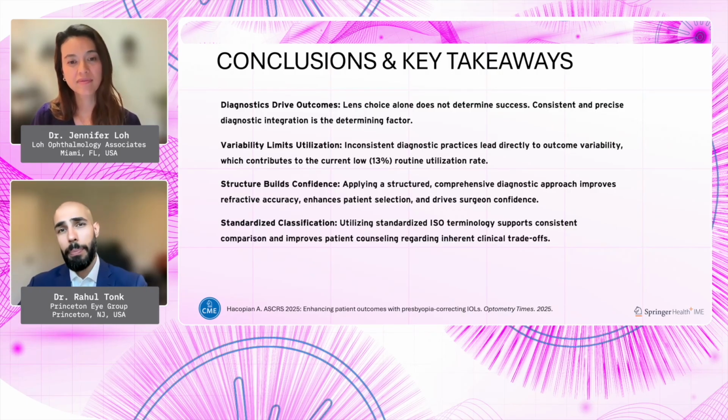And I think one other piece of comfort with presbyopia-correcting lens technology is having some familiarity with how to do an intraocular lens exchange. And I'm talking about a bag-to-bag exchange. I think just having that in your back pocket and knowing that you're able to do that will create a tremendous comfort level with starting to break into these lenses.